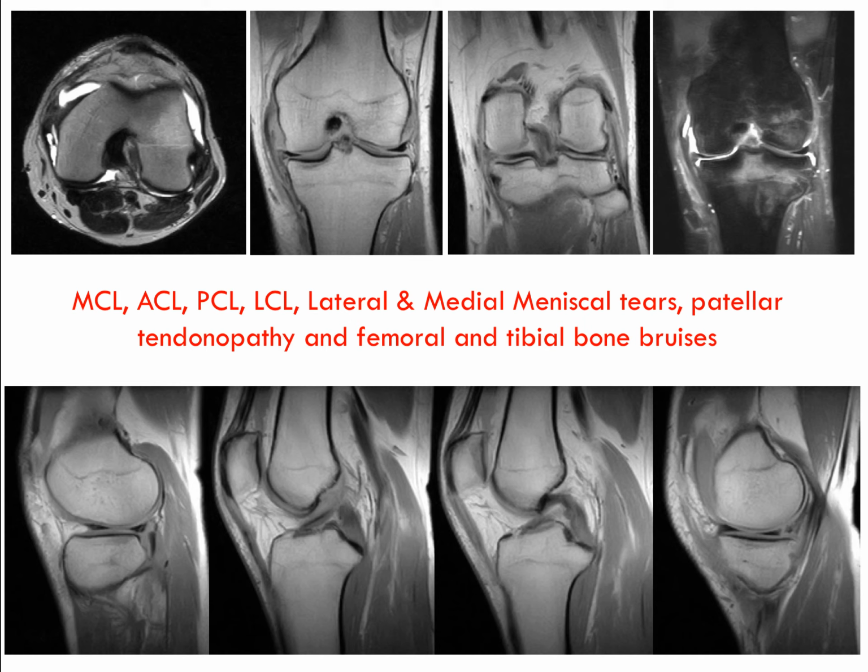We have Canon Medical supporting Manchester United, FC Barcelona, and a few of the other teams as well. And they've developed quite an interest in using MR, mainly because of the fact that it doesn't use ionising radiation.